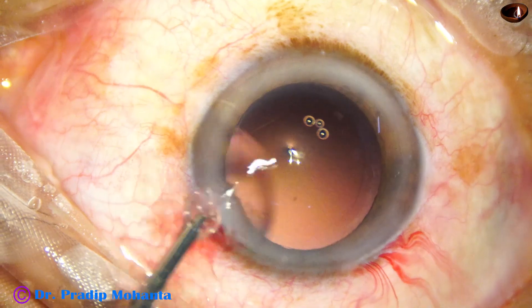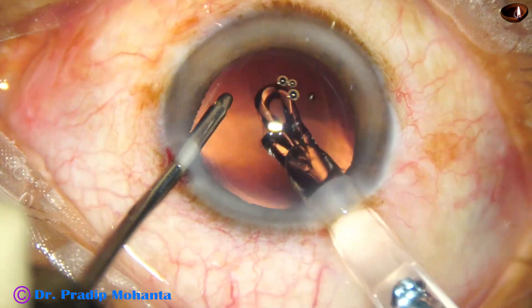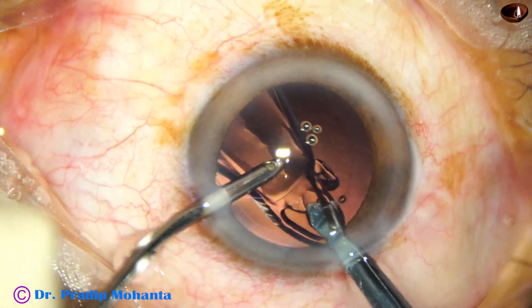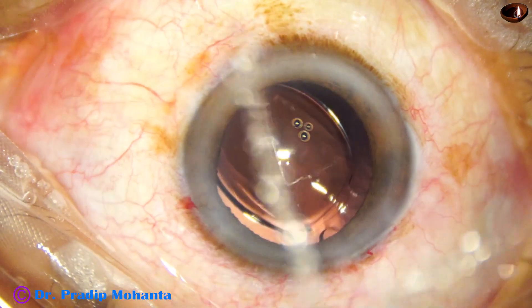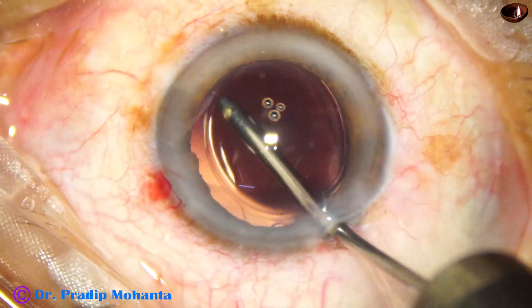Now hydro-implantation of a single-piece monofocal intraocular lens is done. See how just a tap of the left hand instrument sends the trailing haptic into the capsular bag.